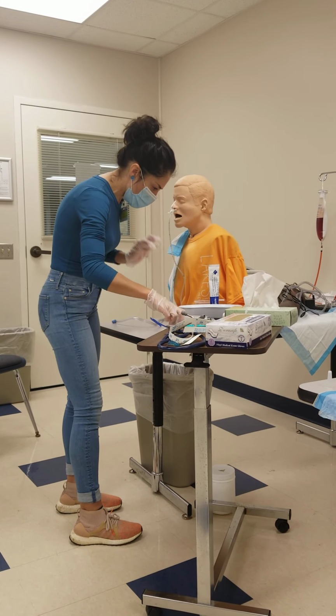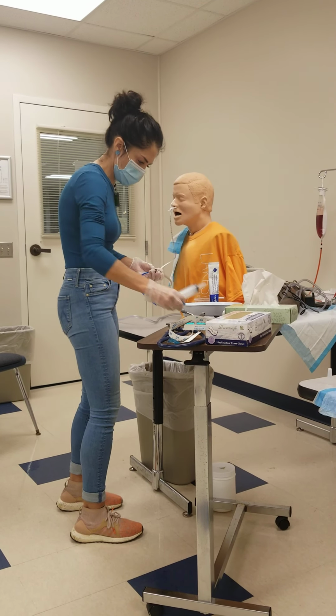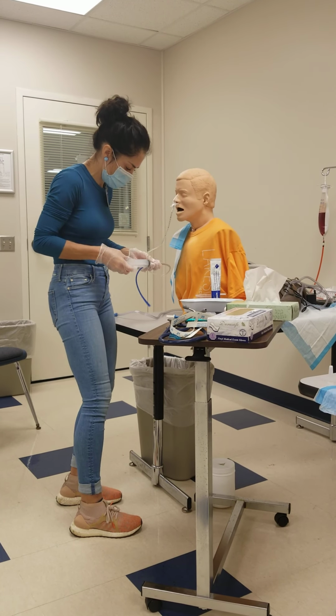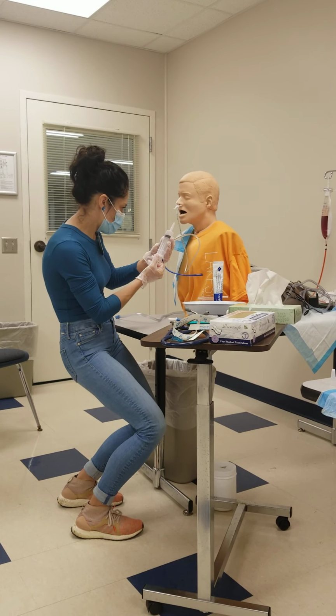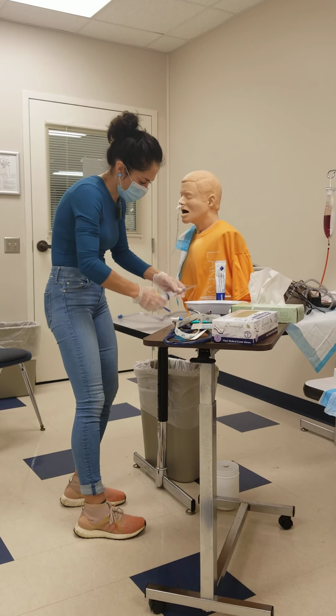And then another way to confirm placement is, we're going to push in, or instill, 10 to 20 milliliters of air.